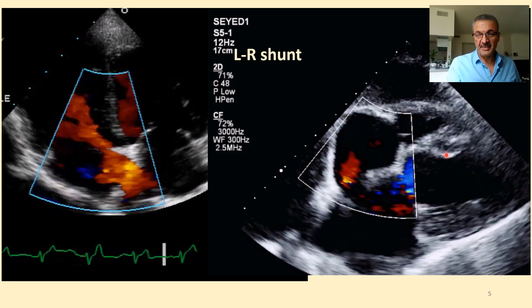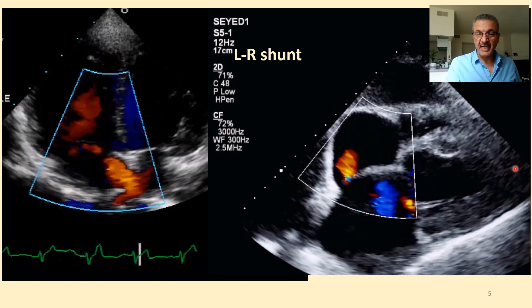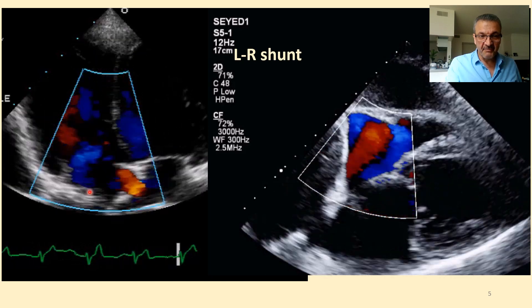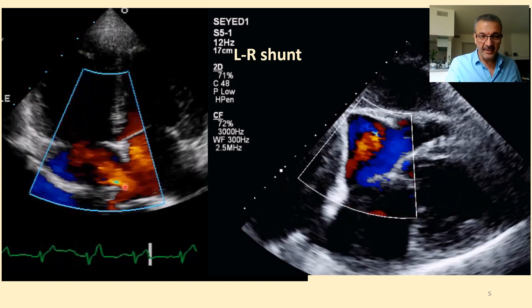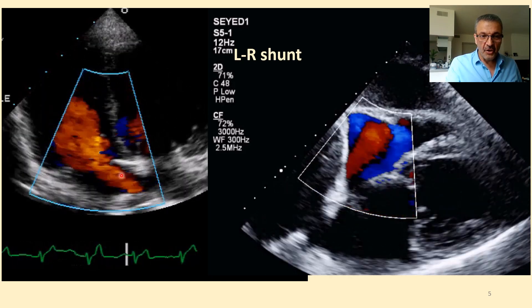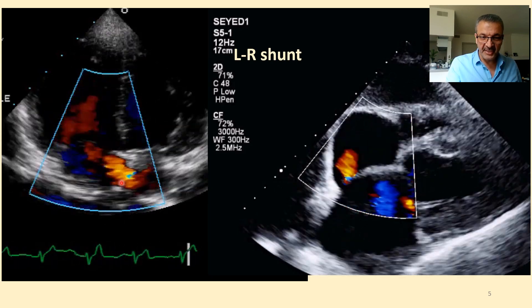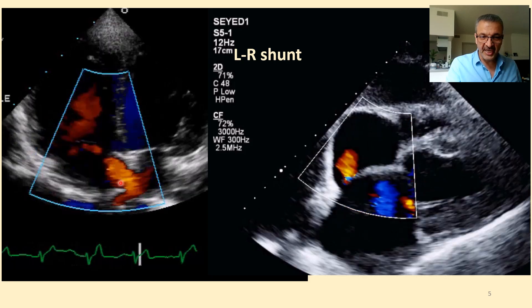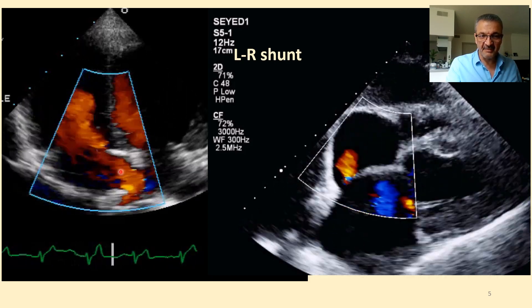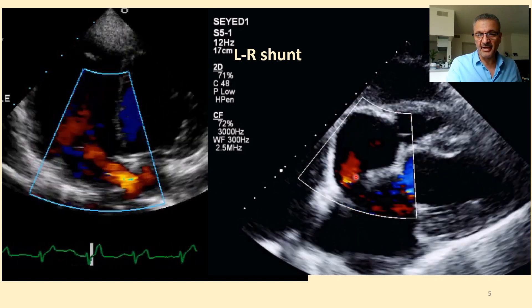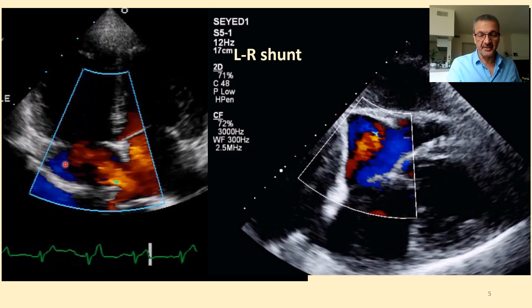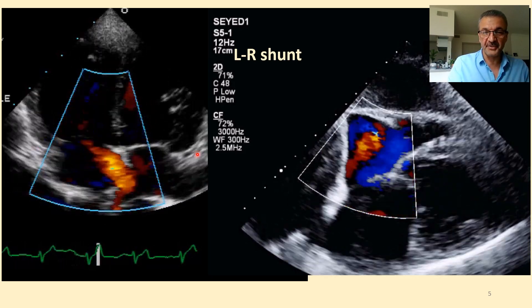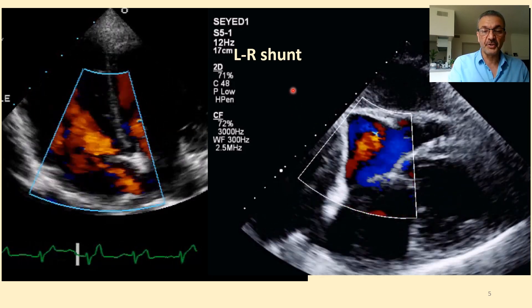In the bubble test, as you see here, when we inject bubble, the bubble cannot fill that area because there is a jet pushing the bubble away from this region. So you can see a filling defect in the bubble at that area at that moment. We have a bubble filling defect on the right atrium in the left-to-right shunt.